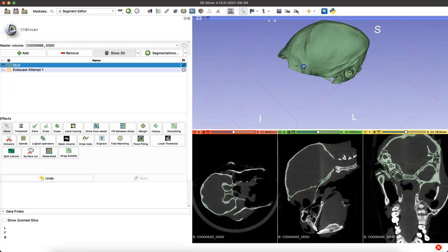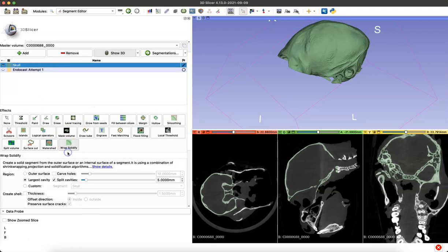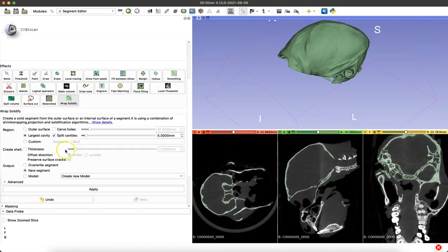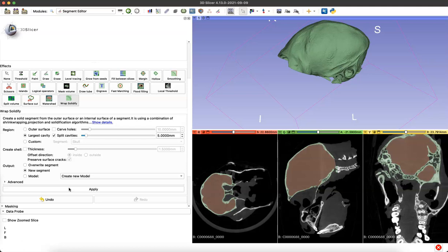Now that we've segmented the vault away, we're going to run the WrapSolidify program again. I'm going to navigate to that module. Our settings are exactly the same: largest cavity, split cavities, and new segment. I'm going to click apply again. The cleaning we just did won't always be necessary, and I think it was just the vertebra in this model that threw it off.